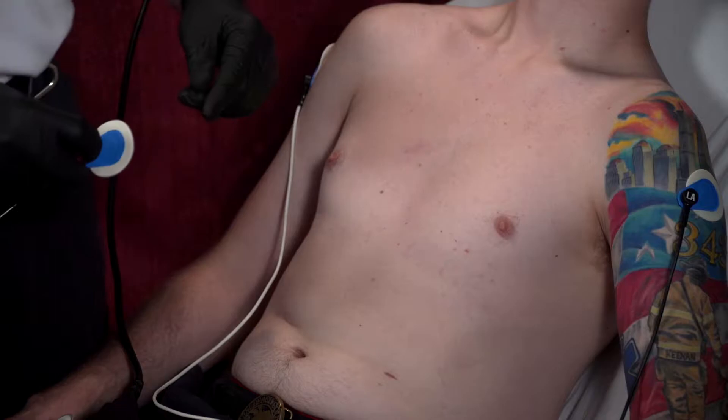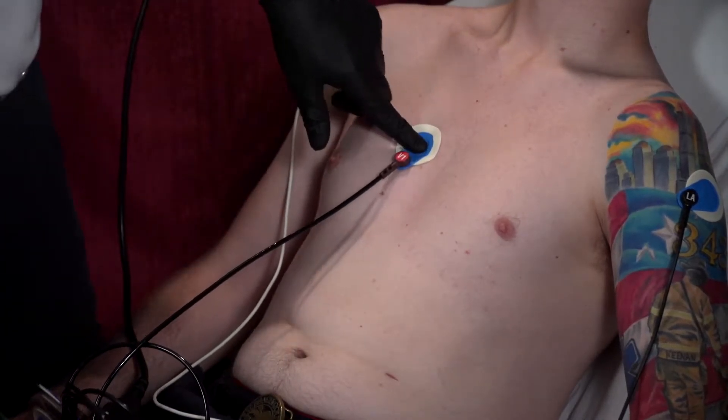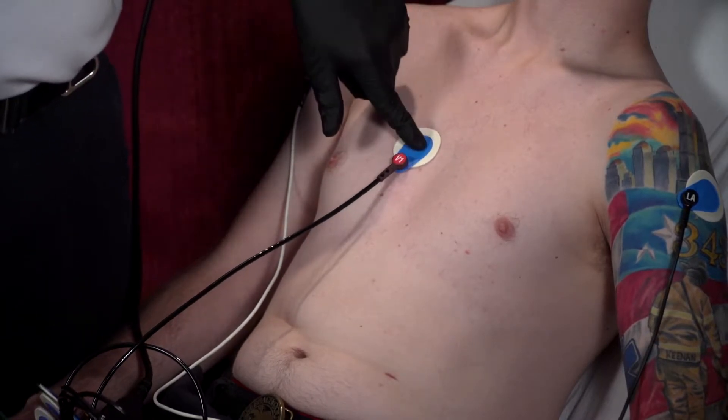Once we have our limb leads in the proper place and we can confirm we're getting a clean EKG, we're going to place our V leads in the proper location. Let's go over the placement quickly. V1 goes in the fourth intercostal space on the patient's right side, and that's going to be parasternal. So V1 is going to go approximately in that fourth intercostal space.